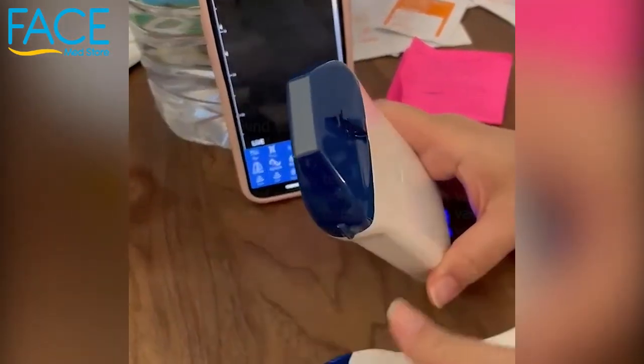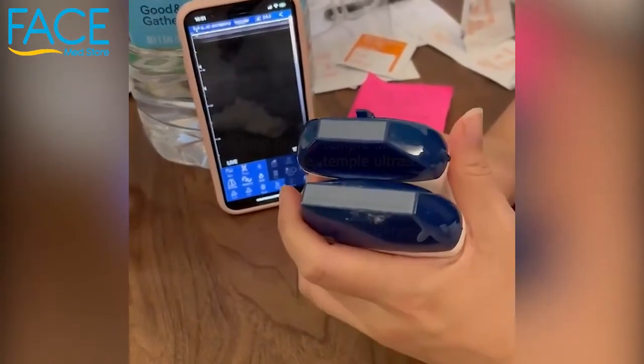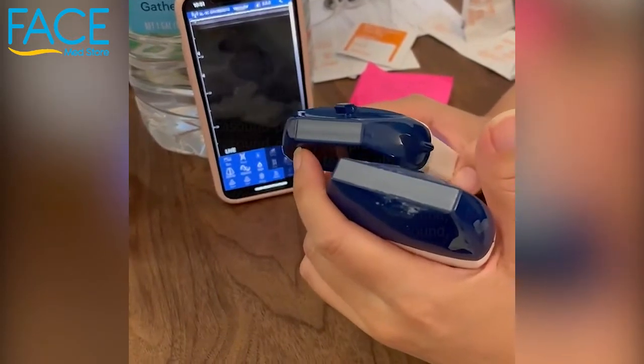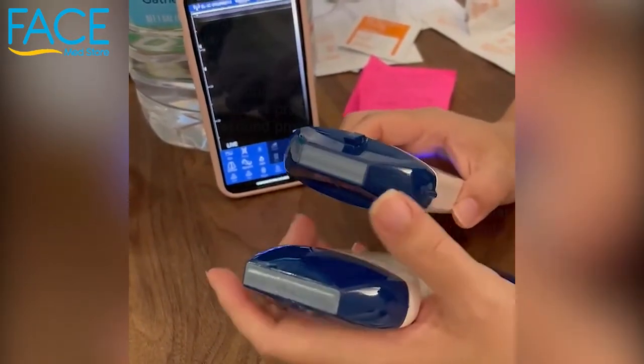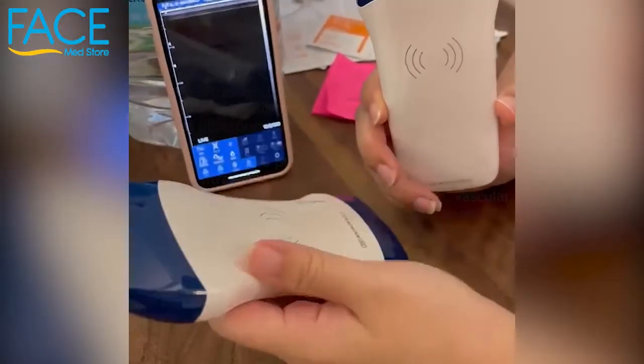What I wanted to show you guys was the difference in the size of the head. So if you're doing something that's very small — a small area where you're looking for nasolabial folds, maybe the temporal artery — you may want to use a smaller one. This probe has the curvilinear and the straight edge, which is good for vascular.